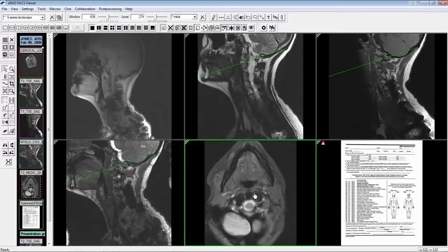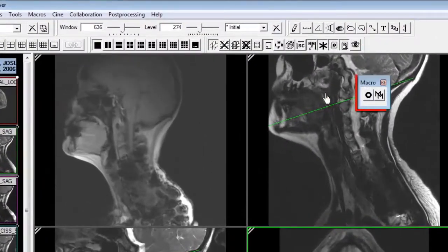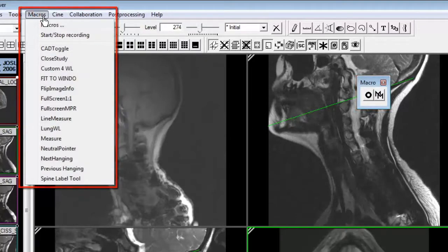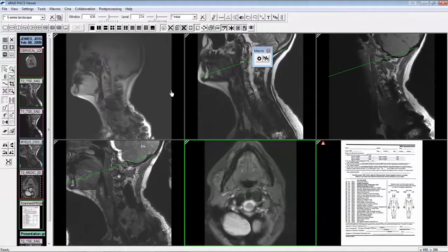The next feature is the macro feature. Assigning a viewer function to a key on the keyboard, third-party hardware device, or a custom right-click menu is now possible with the keyboard macro functionality. This functionality has its own toolbar and top menu. To record a macro, perform the following steps: click the record button on the macro toolbar or from the top menu.